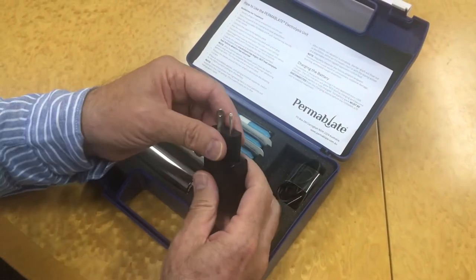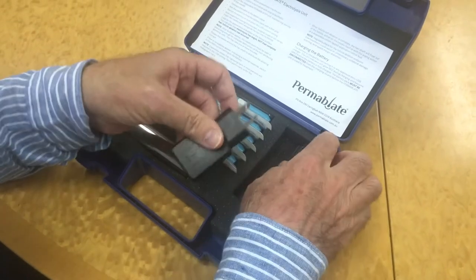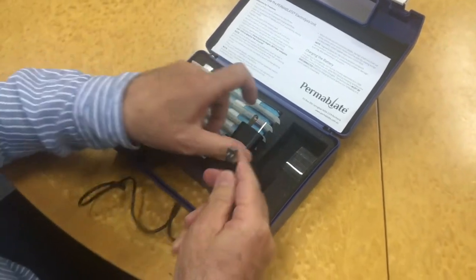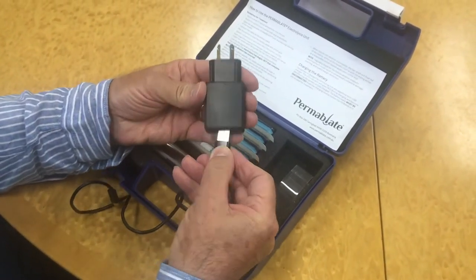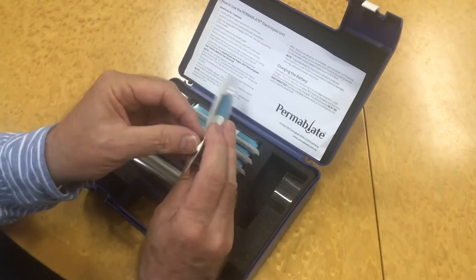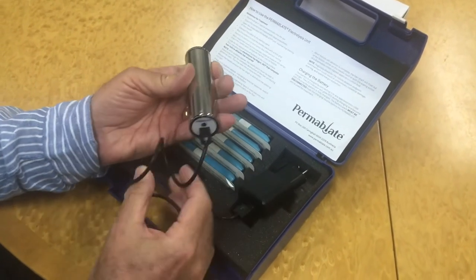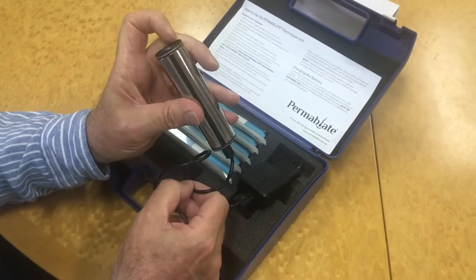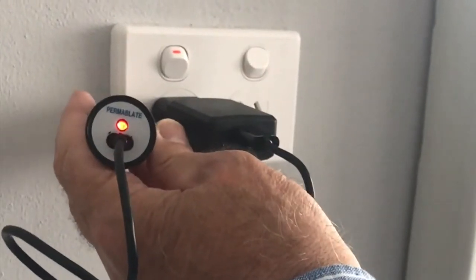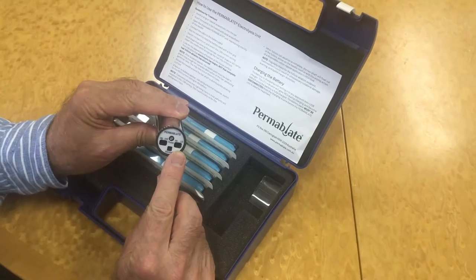The Permablate Electrolysis Instrument comprises a mains electric power unit used for charging the reusable rechargeable battery and a disposable sterile single-use needle housed in a pencil-like handle. Charge the battery by connecting it to the mains electric power supply. The light on the battery will glow red on connection and become green when the battery is fully charged.